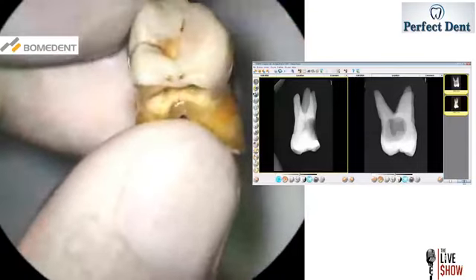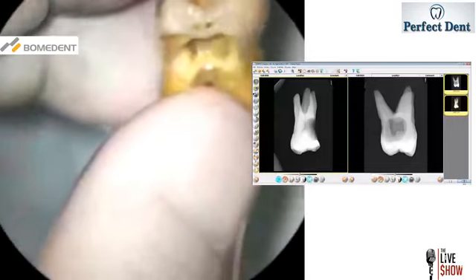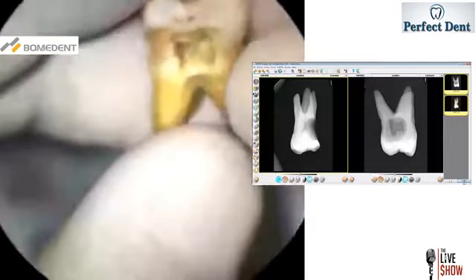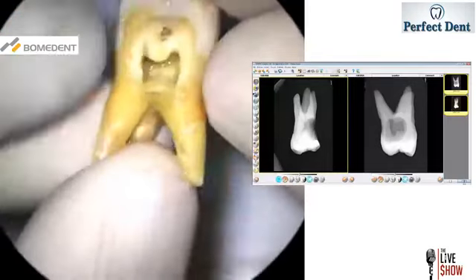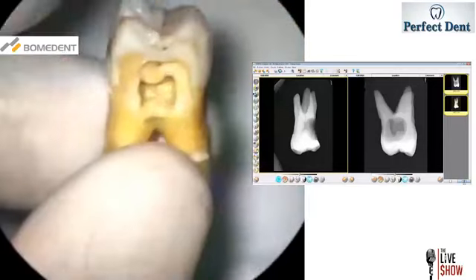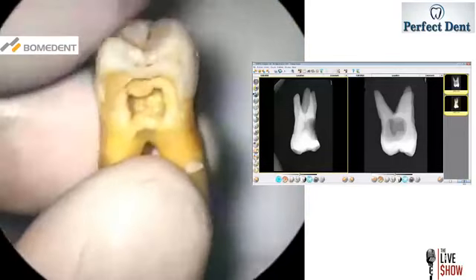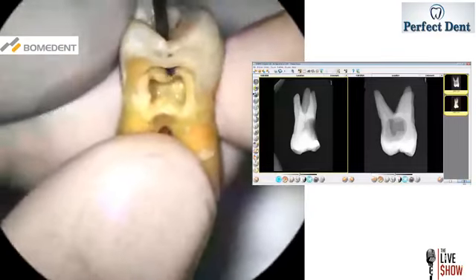Okay. Endo-Z. Endo-Z, please. Okay, so I'm waiting for my assistants to wake up. And all right, so let's go in now. I go into the Endo-Z. Go ahead, start.